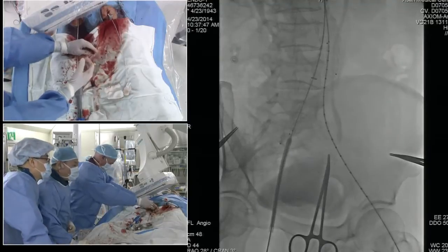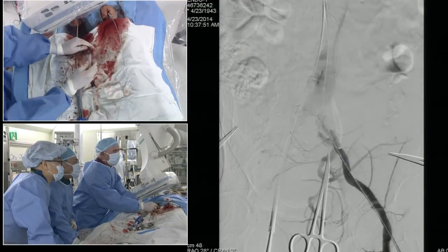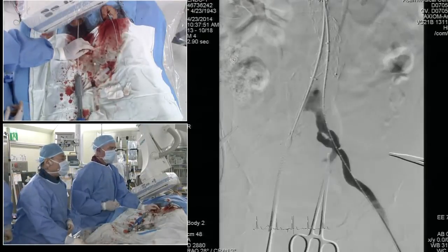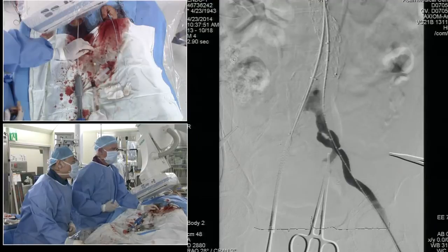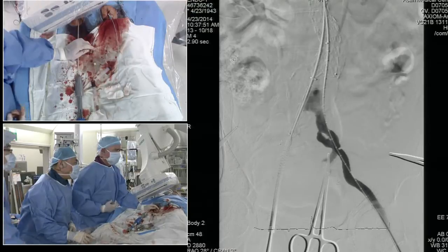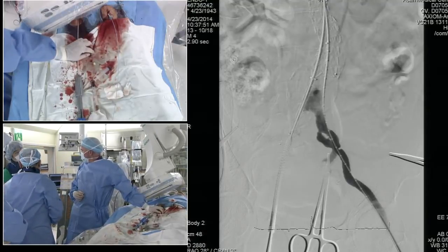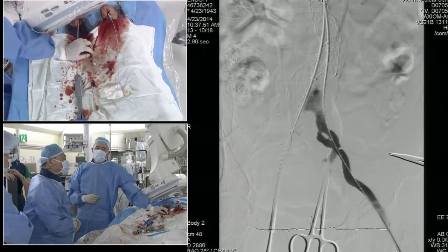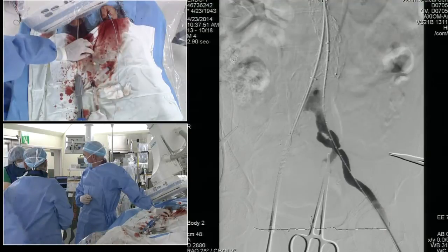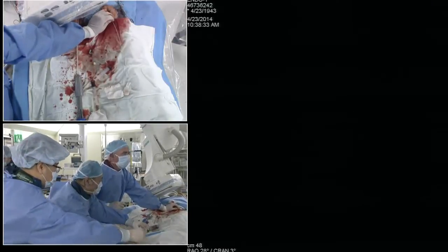Okay, so retrograde angio here. Okay, so let's stop the image when it's full, if we can. So I'm seeing 1, 2, 3, 4, 5, 6, 7, 8, 9 centimeters. Yes. Okay. So we'll take a 93 limb, 16 diameter based on our CT measurements. And very good. We'll take that. And so now we can take the pigtail out.